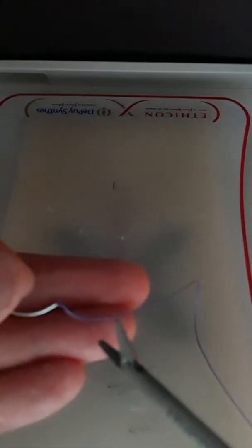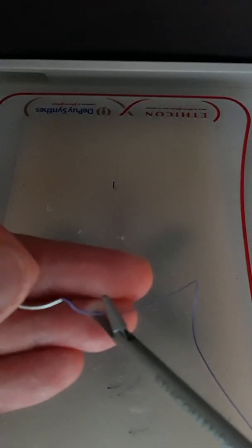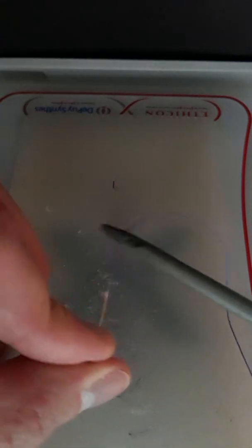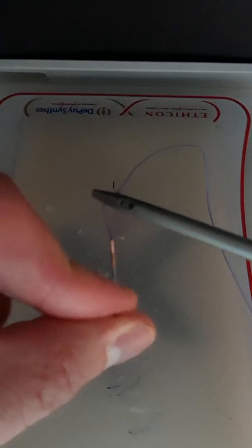Same technique to introduce the needle. Your needle has to be approximately one centimeter away from the suture, and the needle should point towards the patient's head. Again, I'm going to go ahead and introduce. Right now my needle is in, and I'm going to switch my needle to the other hand.